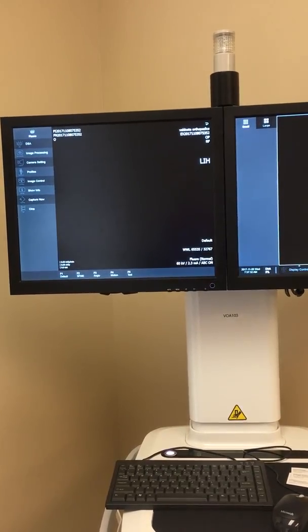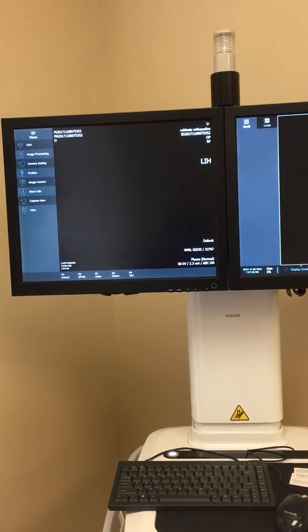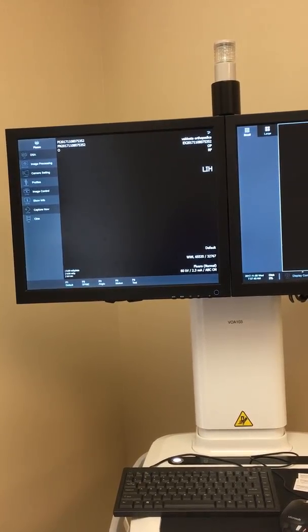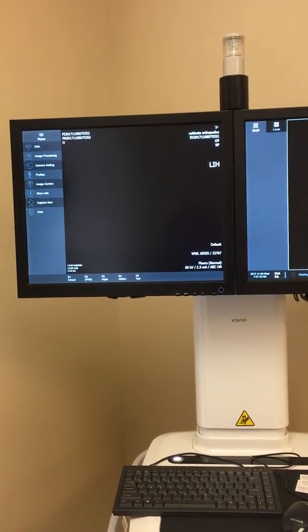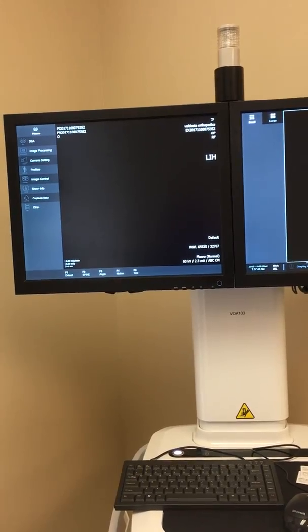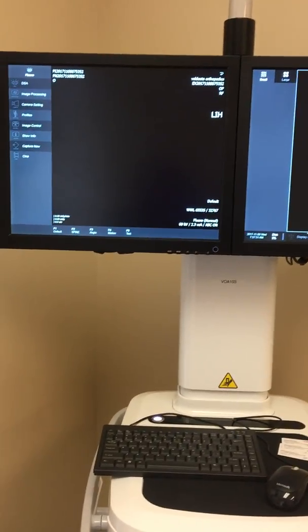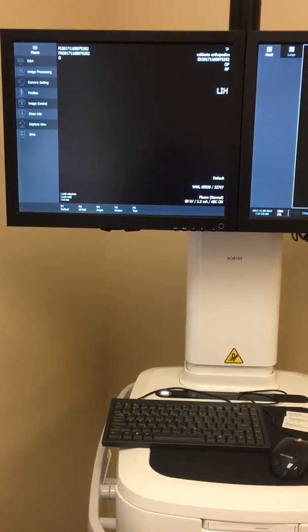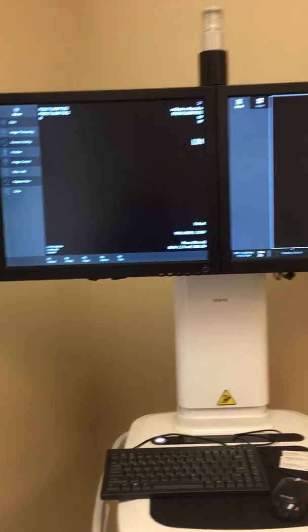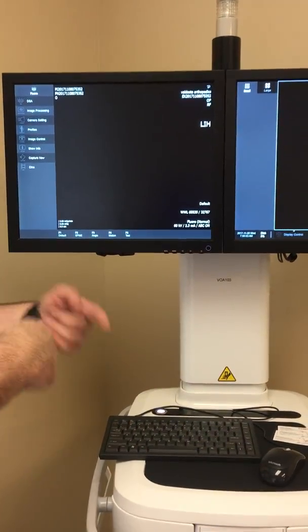If you can get me some sort of network connection, and there's ever an issue or you want me to make a profile for you, I can remote into the system from my house in Pennsylvania and make adjustments. You can test it out and say, yep, that works great, or no, it's not quite right, and I'll make some more adjustments. Same thing if you lose a patient file, or accidentally have patient records overlapped in the same file.